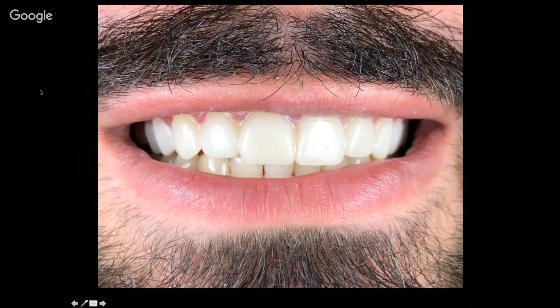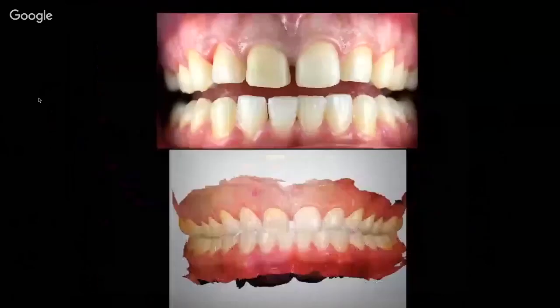After patient acceptance, we analyze the smile, the exposure of the teeth, the relation of the centrals with the upper lip and the lower lip, and mainly the pronunciation. If all is good and fine, we ask the lab to confirm the wax up. If not, we can do small modifications.